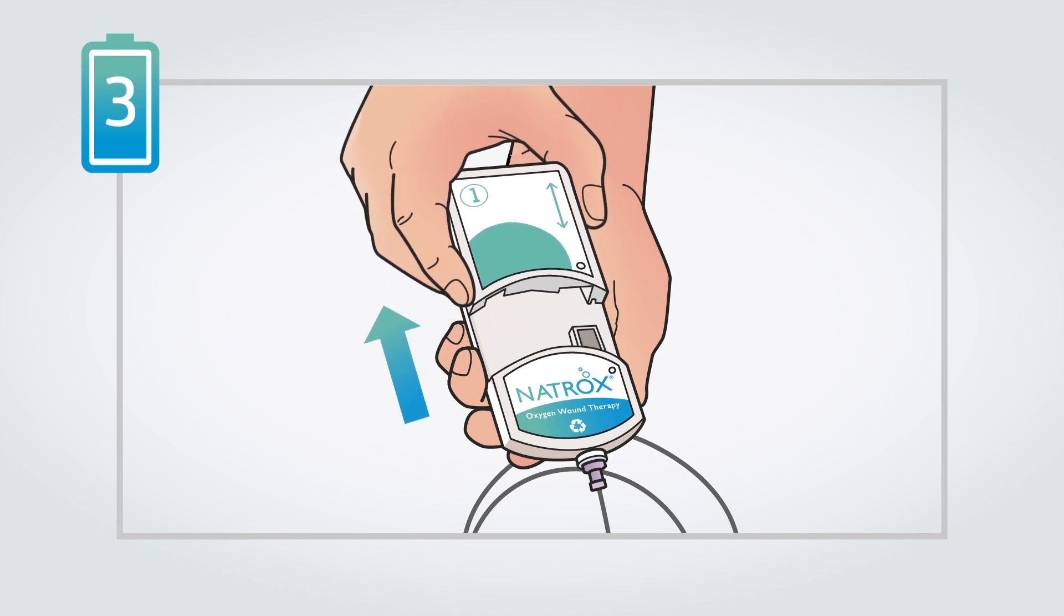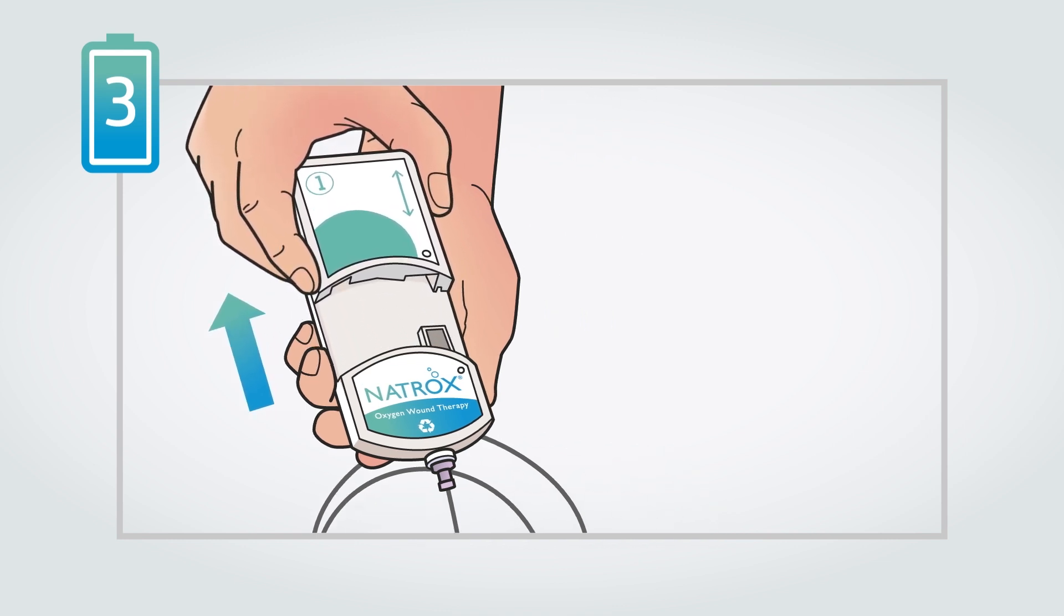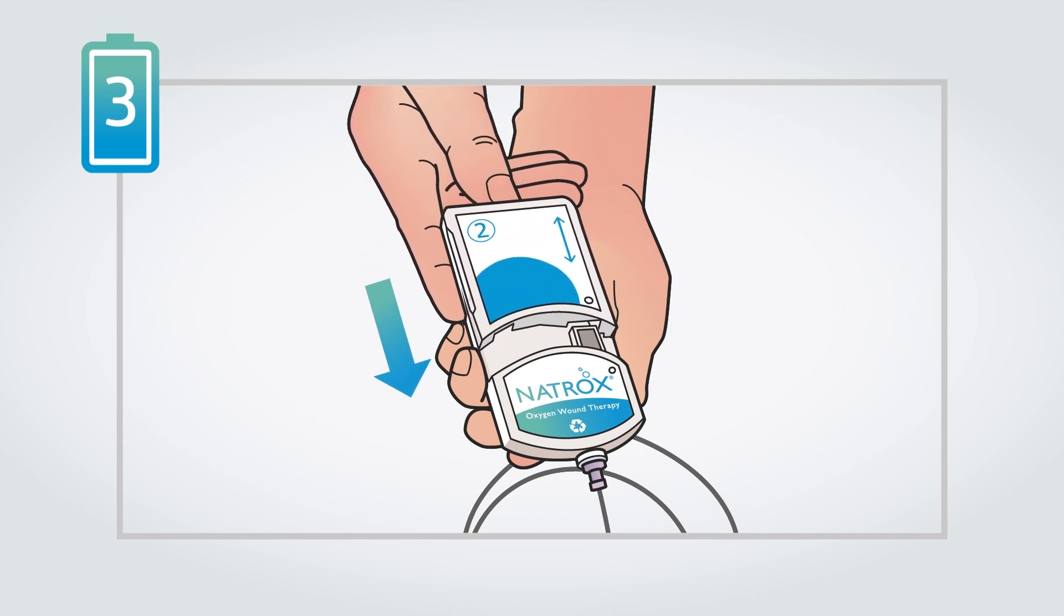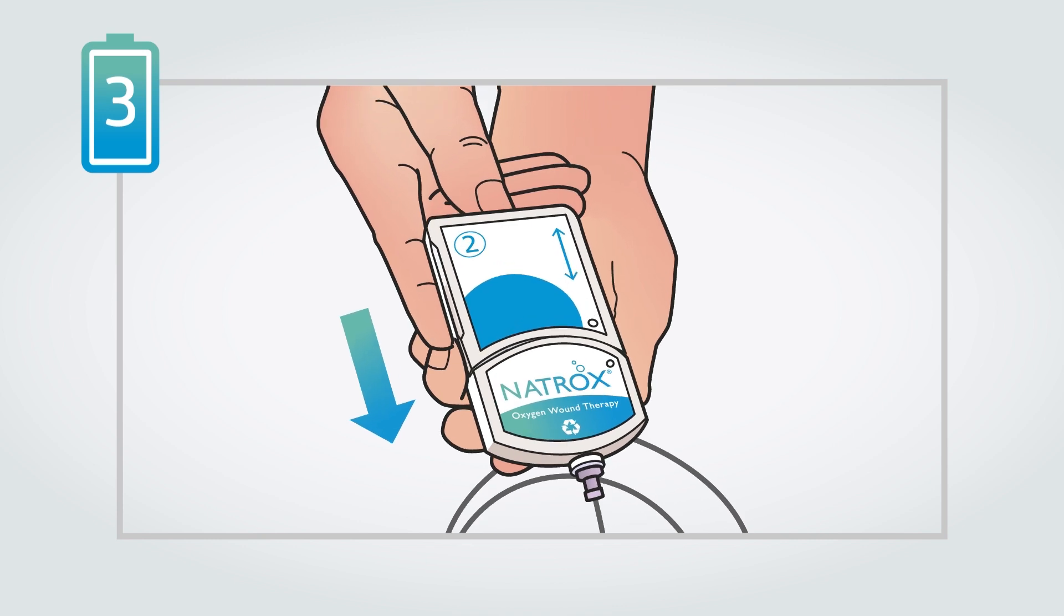simply slide the used battery out of the Natrox oxygen generator. Then slide the newly charged battery into the device. Make sure you feel it click into place.